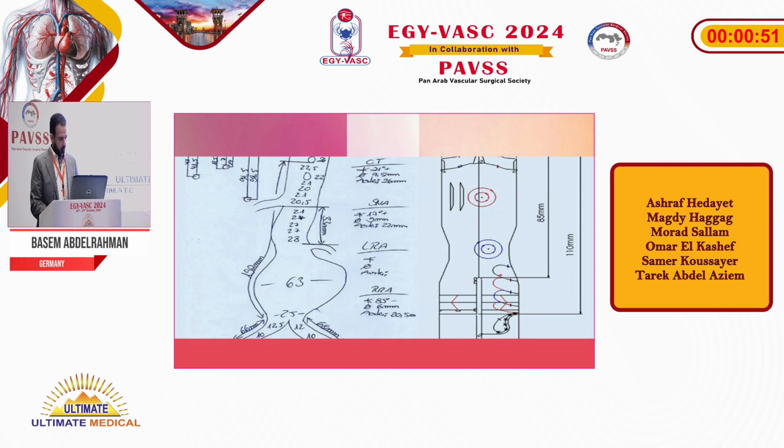This slide shows accurate measurement of the abdominal aorta at different levels above and below the renal arteries.